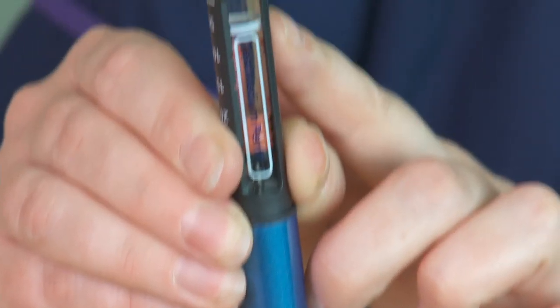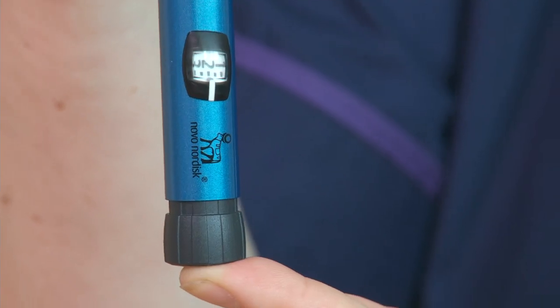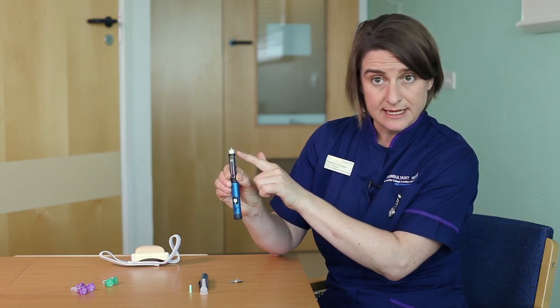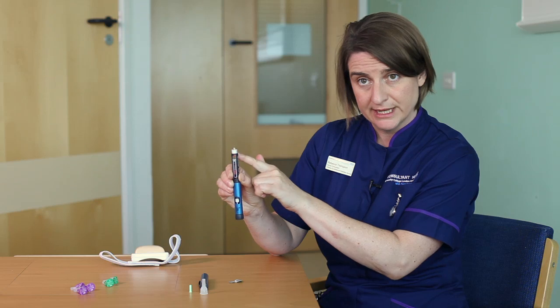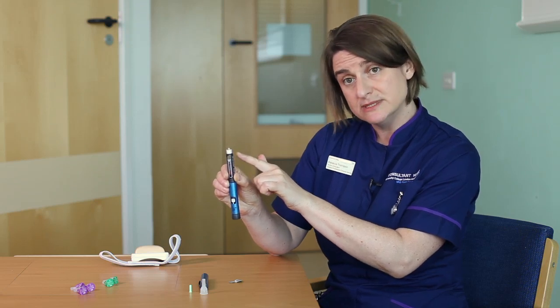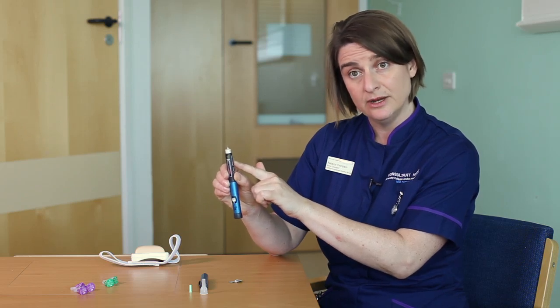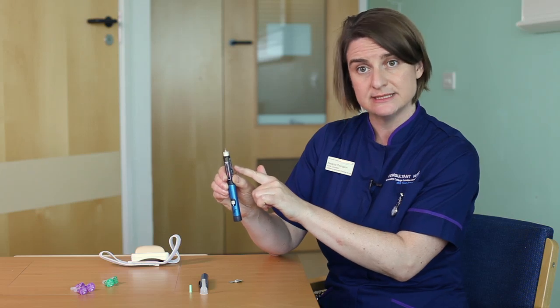So I'm going to dial up four clicks, which is two units, for an air shot. I've dialed four. With the needle facing the ceiling I'm going to push on the end of the pen, and you expect to see some insulin escaping from the needle. If you don't see anything coming out the end, repeat the process again with another two units as an air shot.